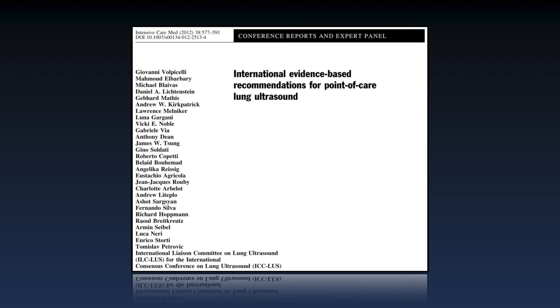We're looking at an A profile. We're looking at a B profile. Now, my analogy breaks down a little bit as we get into pleural effusions and consolidations. But the implication for why I'm even spending time talking about this is that there's going to be some broad overlap between profiles and patients' ultimate pathologies. You can't say this profile equals this ICD-10 code. You can't say this profile equals pneumonia, because there's various things that present in this way.